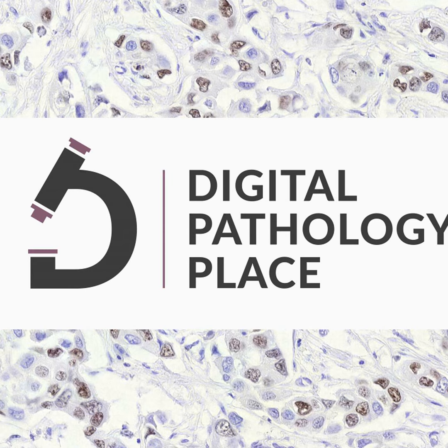And I wouldn't be surprised if once everyone is familiar with deep learning, machine learning, and we solve a lot of the basic problems, and those basic problems are things like cell segmentation, identification of where the tumor is on the slide. These are all great things for deep learning that I don't think a case can be made for using traditional image analysis techniques anymore, since we have the data and the use cases are fairly straightforward. We'll see a transition, I think, once everyone has really caught up, right?